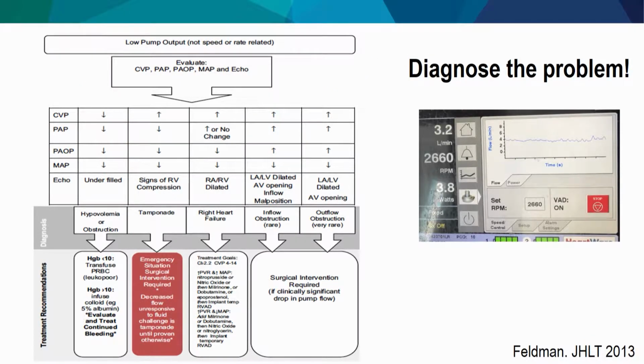As with everything we do in medicine, it really gets down to diagnosing the problem. We've heard already throughout the day about diagnosing the problem quickly and early in the setting of disease. And this is an algorithm that was put forth by Dr. Feldman in an early statement as it relates to the approach of monitoring and evaluating a patient with low pump flow following LVAD implantation.